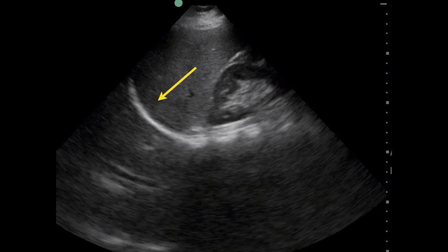If you look below the diaphragm and above the diaphragm, you notice that the texture is very similar. In fact, it's identical. The reason for this is the following. When you have an air-filled structure right next to a fluid-filled structure, it creates such a reflective surface that it actually causes there to form a sonographic mirror. So if what you're looking at above and below the diaphragm are similar, that's called a positive Mirror sign, and that means usually that there's no pleural effusion there.